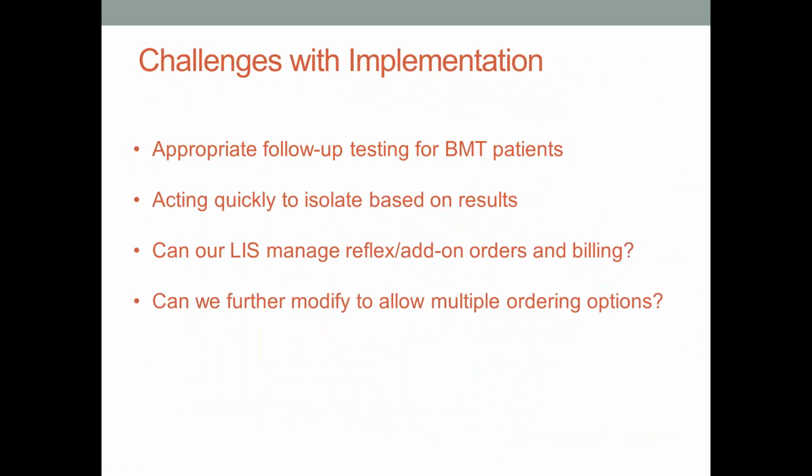So a few of the challenges that we have faced since the implementation are how to follow up with these bone marrow transplant patients who are positive, because they're going to stay positive for a while, and we're not sure what that result means or how to use it, but our physicians want to keep doing the test. So we're still really trying to figure out what that means and how to use that result in that case.